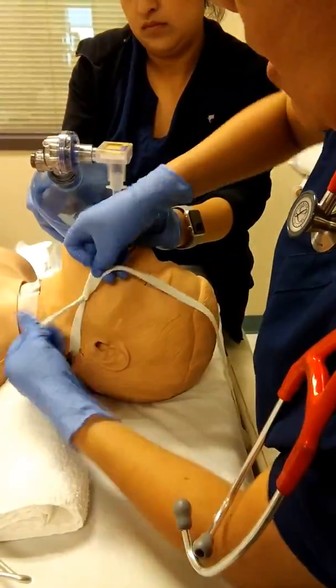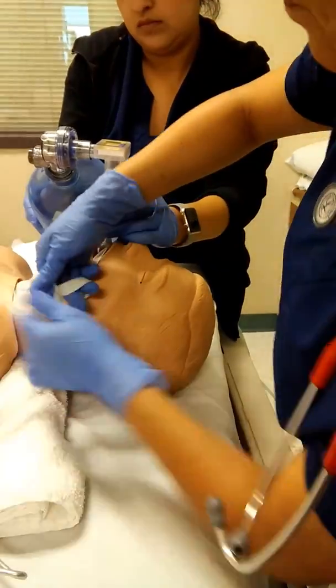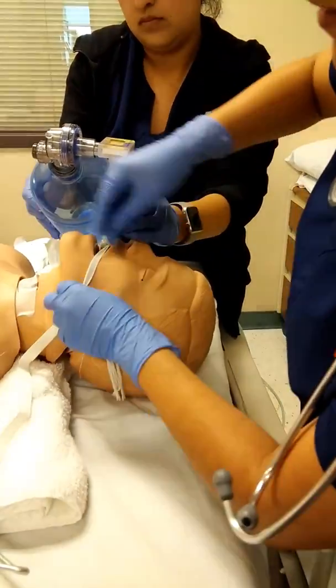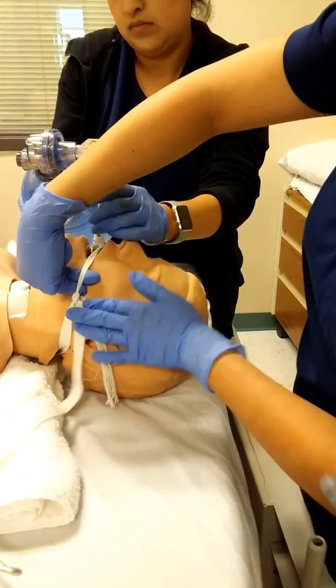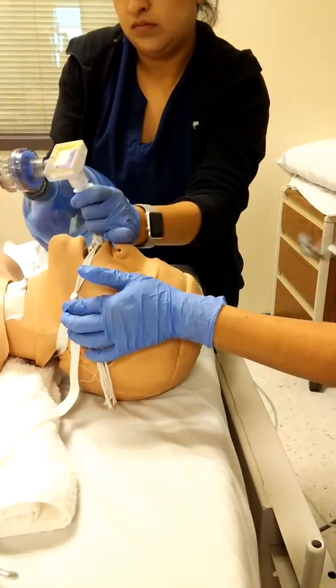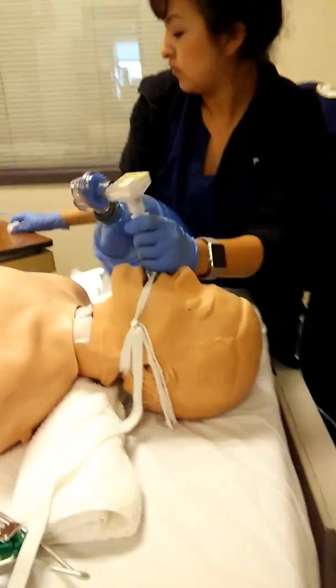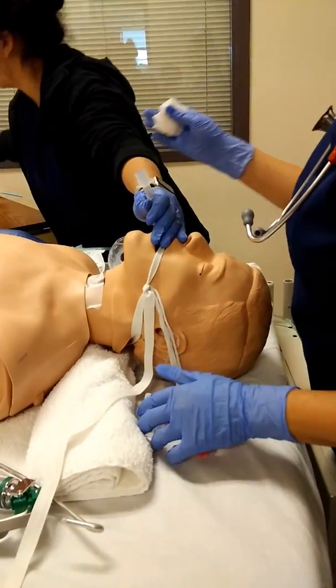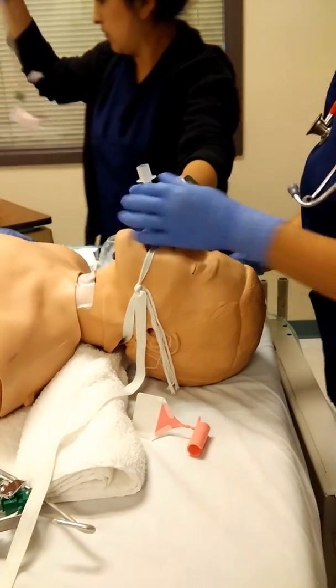Okay. And then if this is too long, then we would just go ahead and cut it. And then we just want to make sure that we could get 2 fingers in. And then we would also obtain, we would place the suctioning tube on the patient.